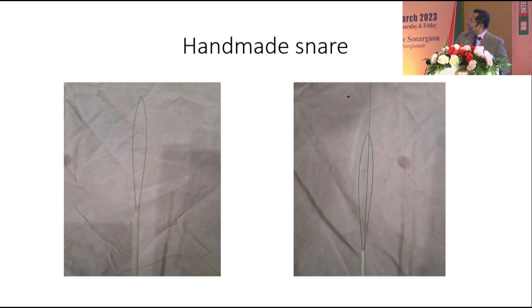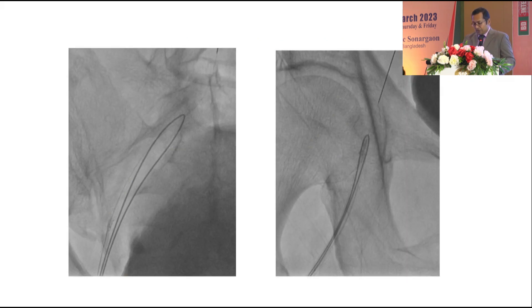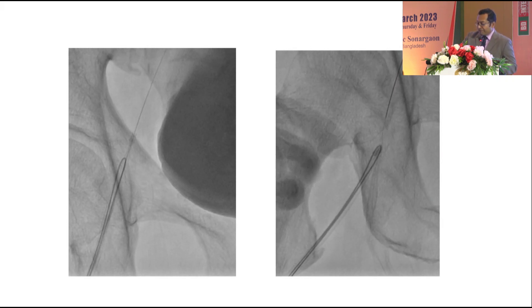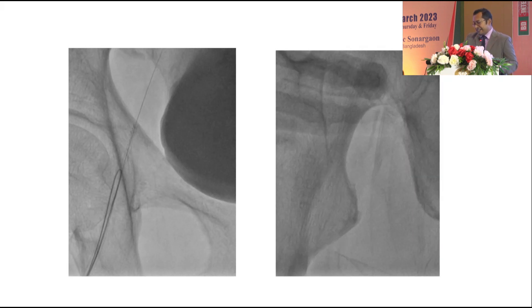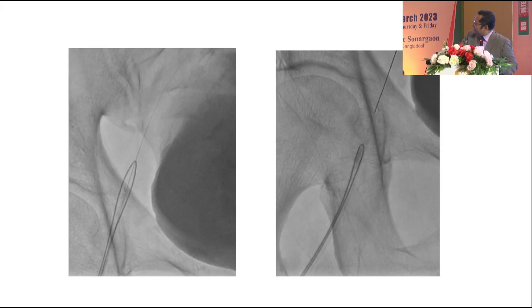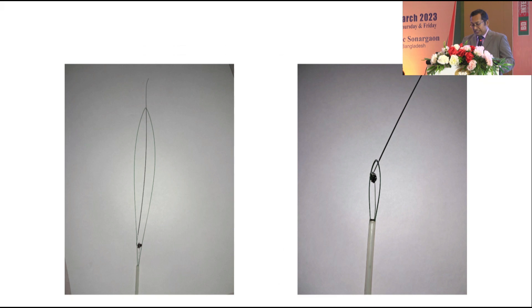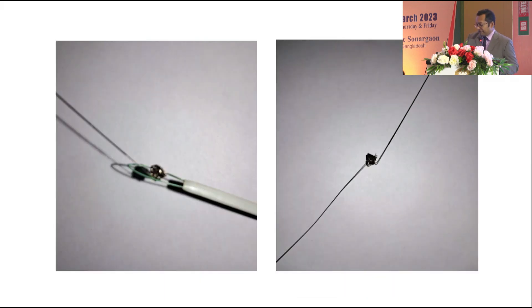Next, we made a handmade snare. The plan was to make a U-loop and, with the help of another wire, form a three-dimensional diamond-shaped snare. We introduced the handmade snare, and on the first attempt we failed to trap the stent, but on the second attempt we succeeded and very carefully and gradually pulled it toward the sheath. This is our handmade diamond snare, and this is the distorted, fragmented, and smashed stent. This is the final picture after excluding the stent with wire.